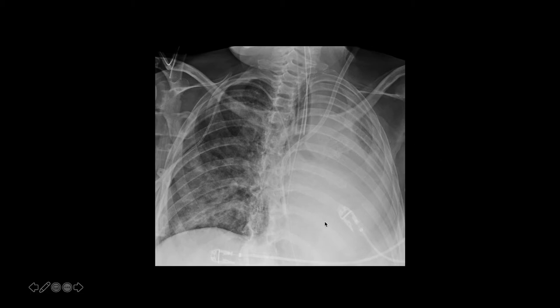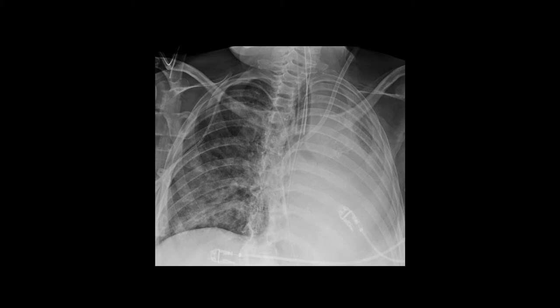Here we see the left hemithorax nearly completely whited out, but the mediastinum has shifted towards that side — we cannot see the heart at all, and there is some tracheal shift as well. The mediastinal shift towards the left in the setting of whiteout implies atelectasis. You can also see cutoff of the left main stem bronchus. This is a case of near-complete left lung collapse secondary to mucus plugging, with probable aspiration in the right lung as well.